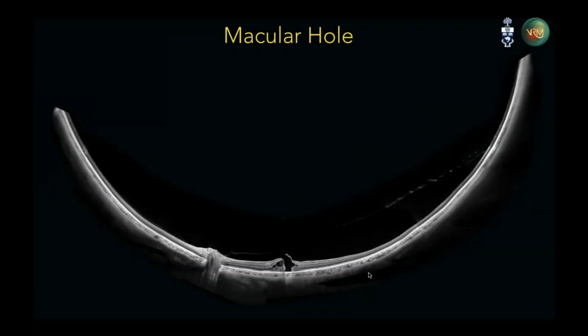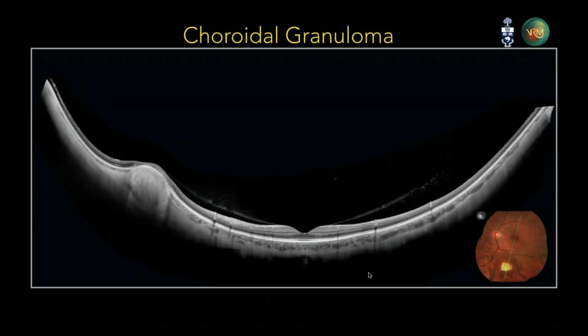Here's an example of a macular hole. This is a very wide field image that was stitched together by our photographer, and you can see the flap of retina connected to vitreous way out into the periphery near the vortex vein. So, a nice example of how you can sometimes really MacGyver the situation to get some excellent imaging, but you wouldn't be able to do this with every single device because the data acquisition can be difficult and the clarity is not there.